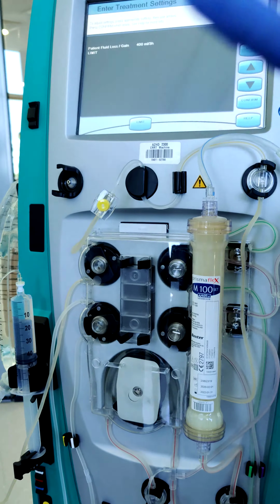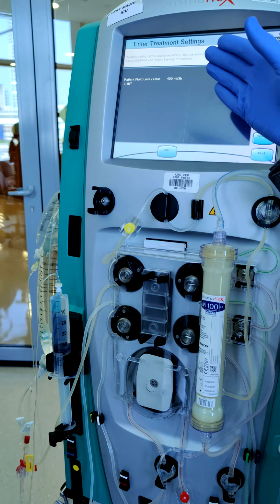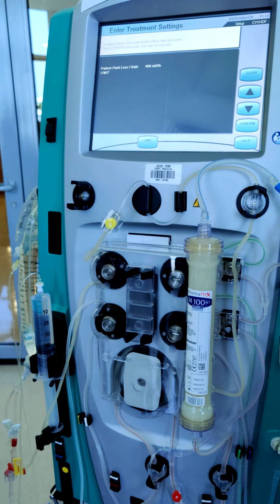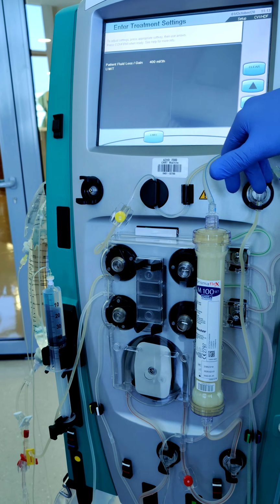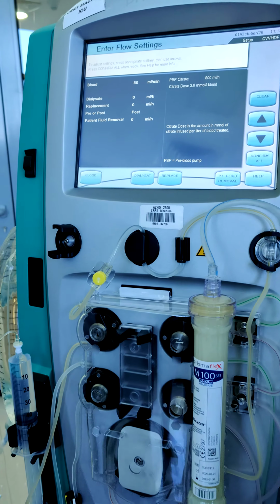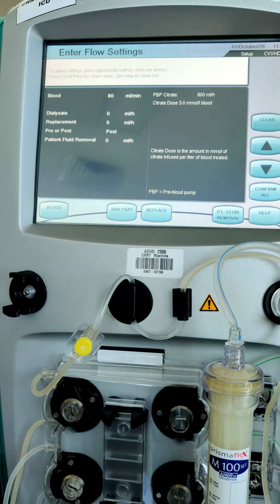What we put is a set volume. Beyond the set, it's unexpected volume. It's not set by our side. It's an error. Okay, now just to confirm, this is our prescription. Here we can follow the protocol.